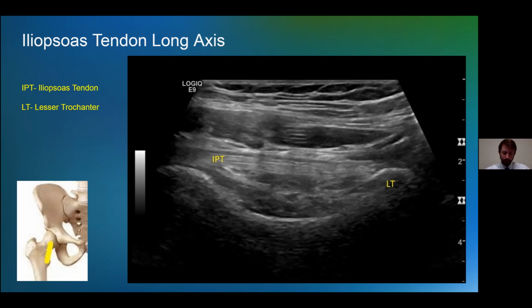So it's of particular importance just to look for the presence of tendon bursal fluid, any thickening of the tendon, as well as any evidence of tendinosis, which would manifest basically as thickening and hypoechogenicity of the tendon itself. So fortunately for our patient, these tendon fibers are nicely tightly packed, and there was no fluid collection and no hypoechogenicity that might suggest tendinosis.